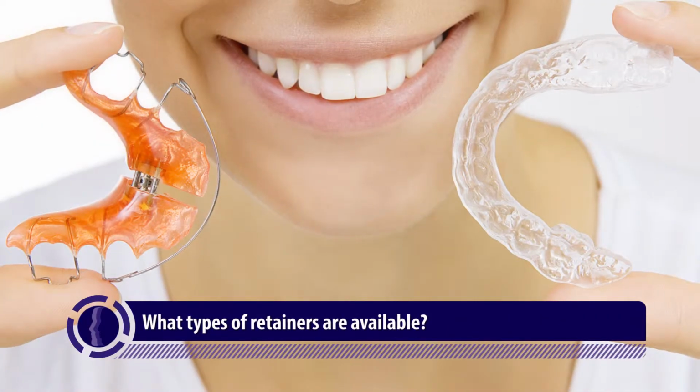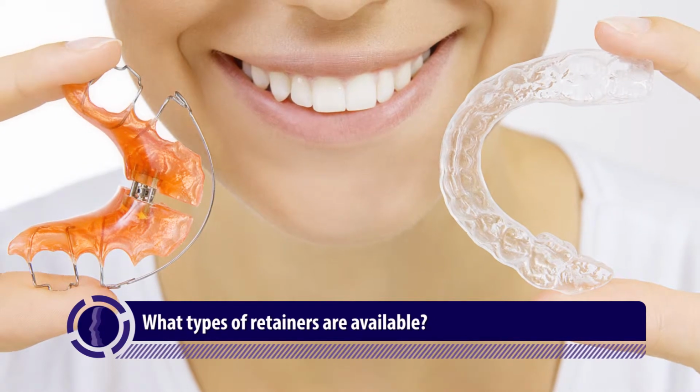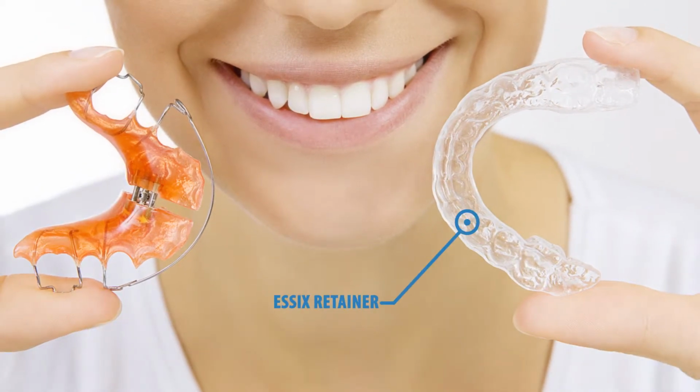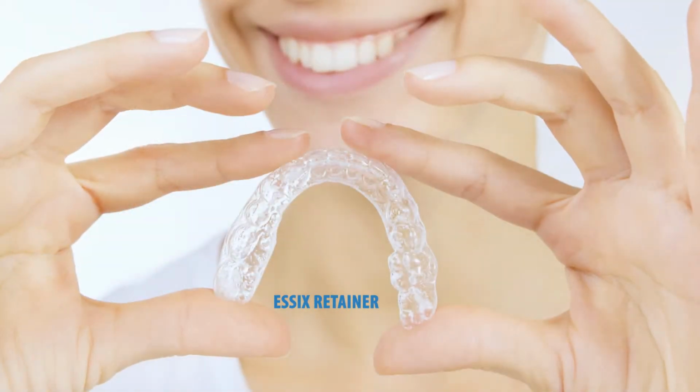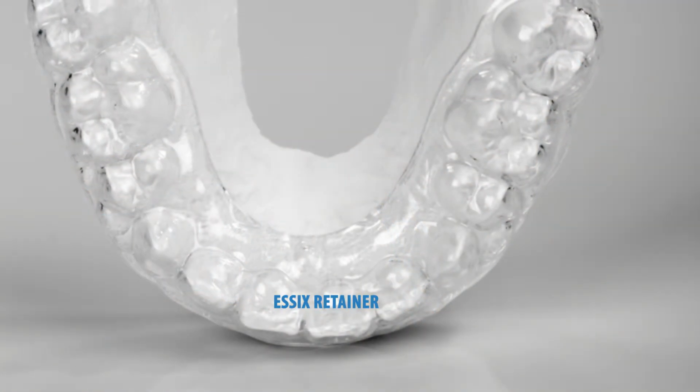Another common question I get is about retainers and the types of retainers that we make. Our most popular retainer is called the Essix Retainer, and that's a clear, almost Invisalign type retainer. The reason it is so popular is it works in a couple of good ways.